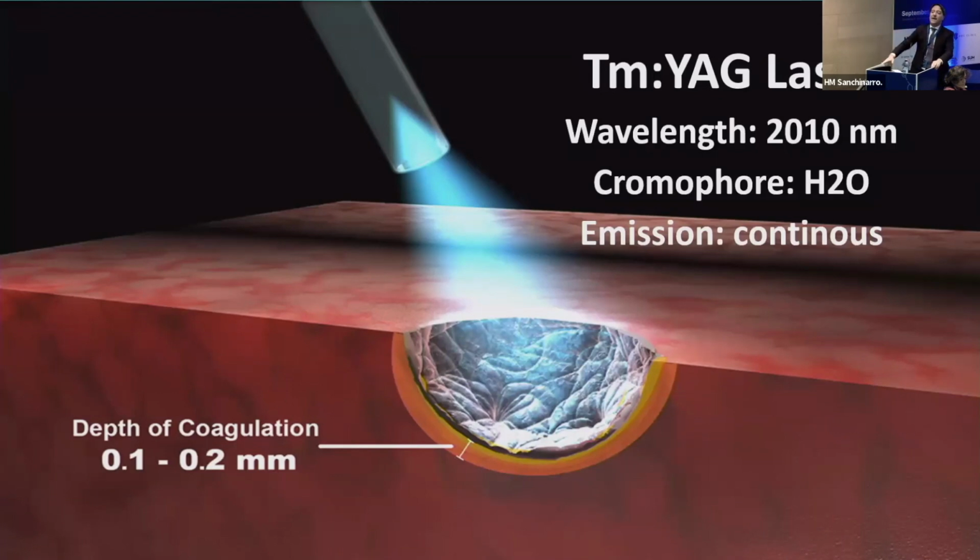Why am I telling you this? Because the big criticism of laser procedures from all the great resectors of the prostate was about irritative symptoms. So they say, well, I'm not using the laser because it gives a lot of irritative symptoms. I prefer the TURP. I prefer the transvesical enucleation.